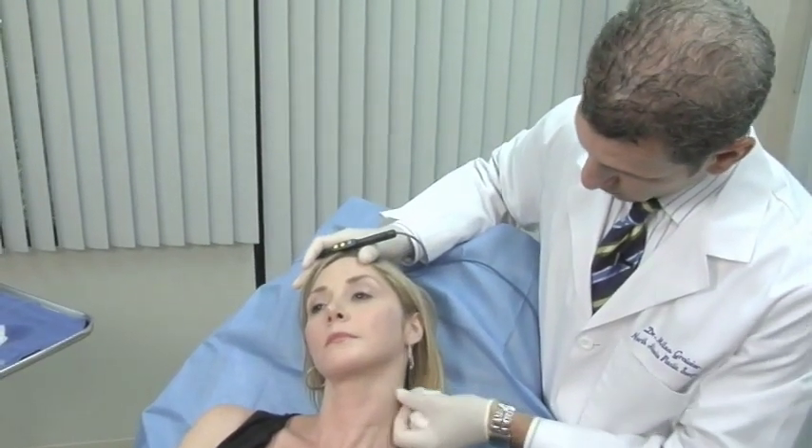We've essentially done five lesions on Leanne — they're taken care of. You can see she really doesn't have any significant bleeding or erythema. We're going to put some little dot band-aids and a little dab of antibiotic ointment, and she'll be able to go about her business. We'll check up on her in a few weeks. Leanne's had lesions removed with other methods in the past — how did this compare? 'This was so much better. It did not hurt. Other doctors would razor it off. This was so much better and did not hurt — I think they'll have much better results.'